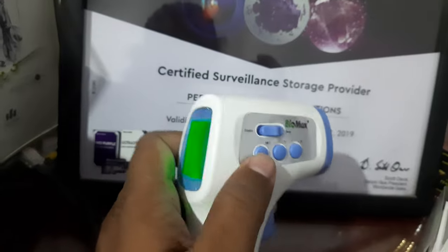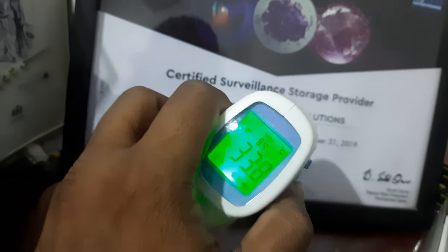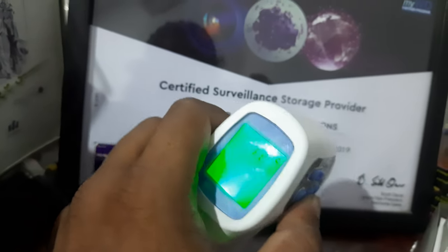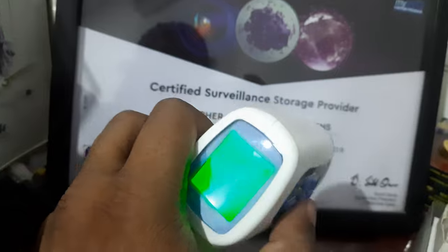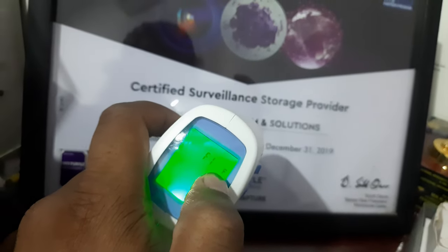First, I'm going to long press this first button. Now it is in C — I'm going to change it to Fahrenheit. When I press this, it becomes Fahrenheit.